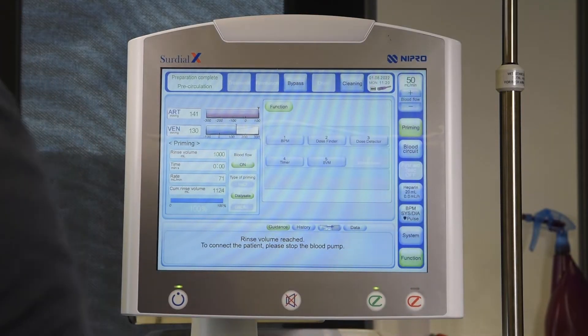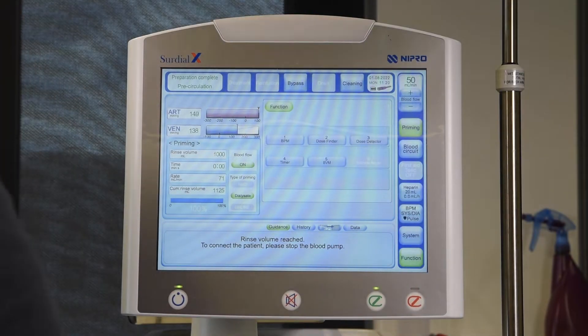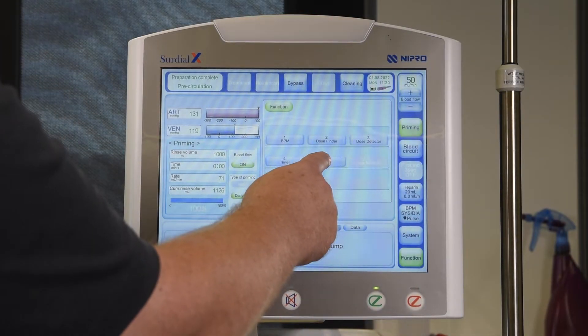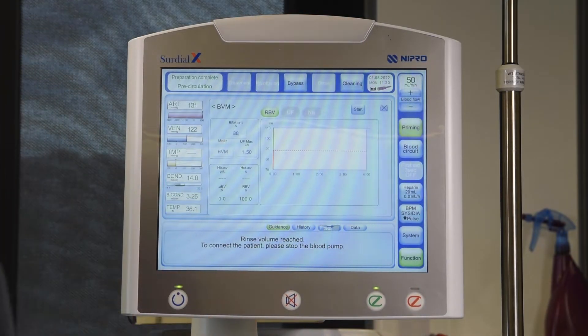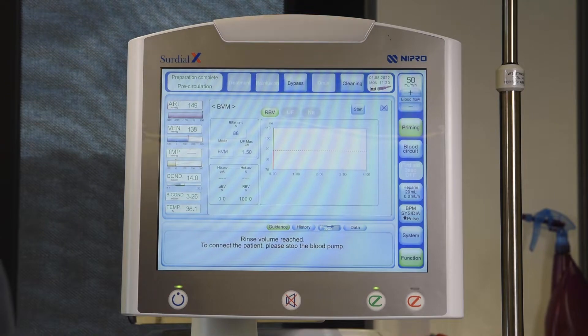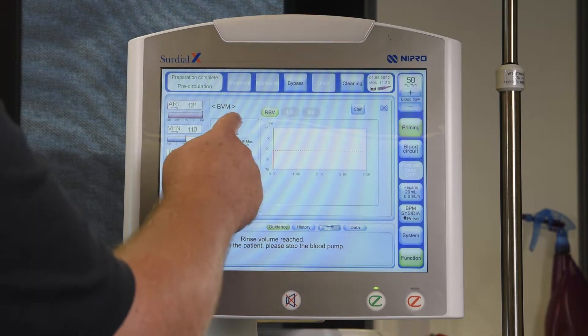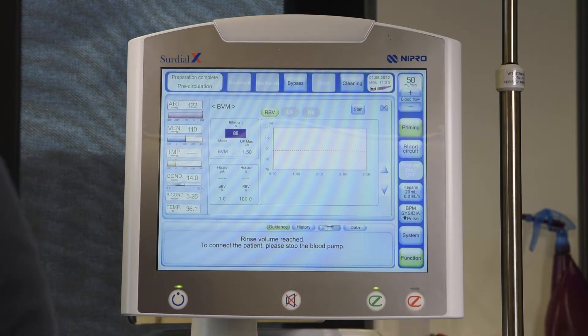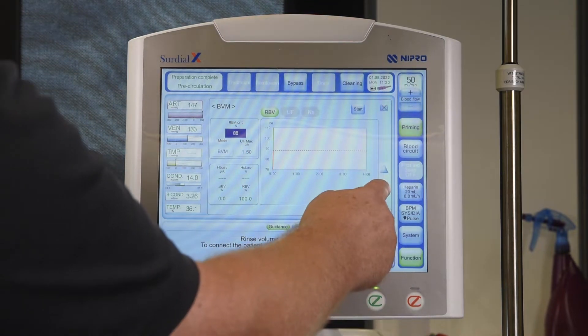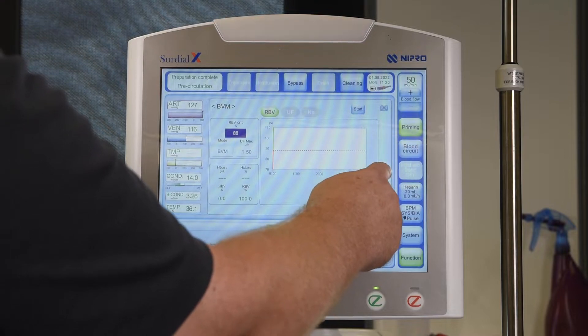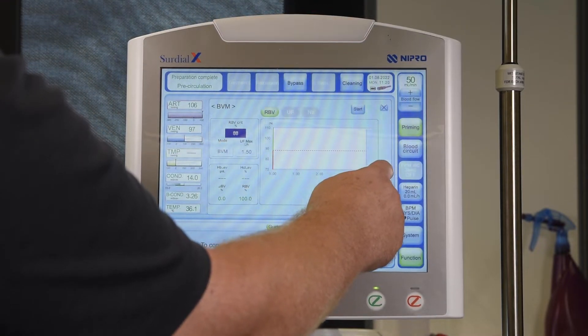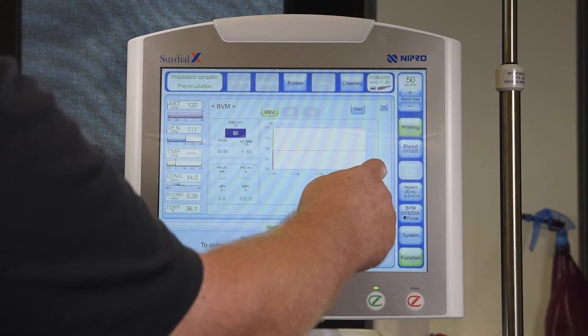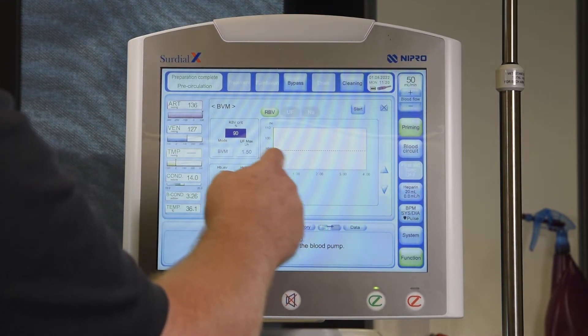Press Function and then BVM to get to the BVM menu. To set the critical RBV, highlight the number. Use the arrow keys appearing on the right to change it. To confirm, touch the number again.